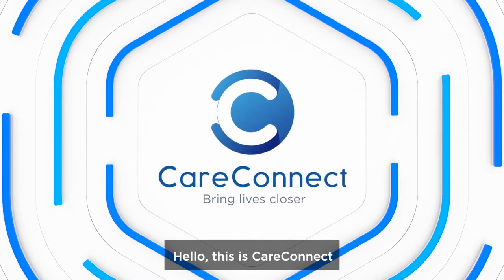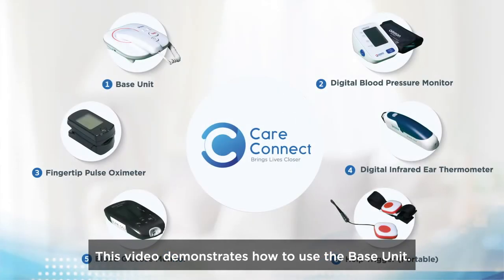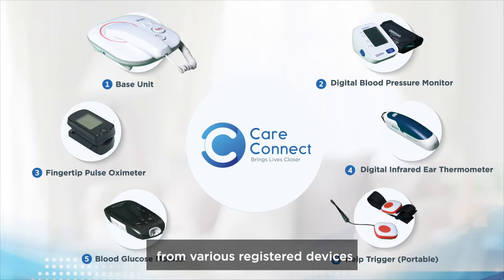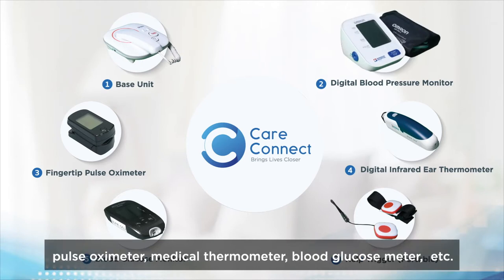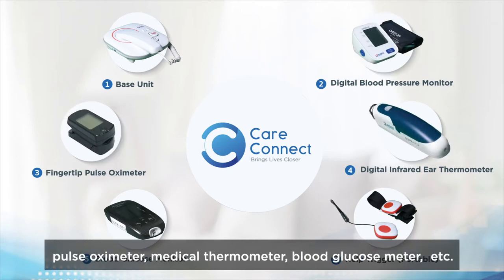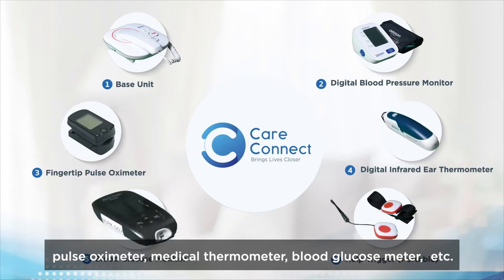Hello, this is CareConnect. This video demonstrates how to use the base unit. The base unit is responsible for receiving signals from various registered devices such as blood pressure monitor, pulse oximeter, medical thermometer, and blood glucose meter.